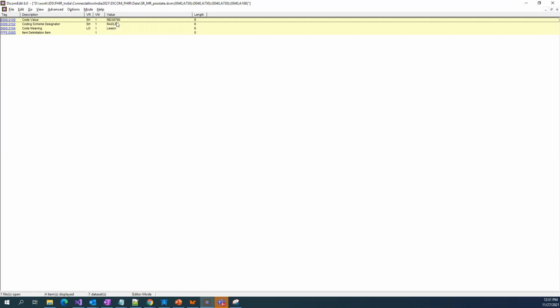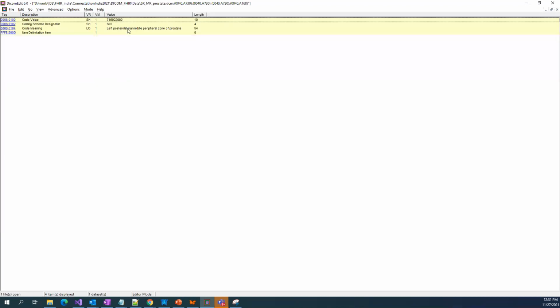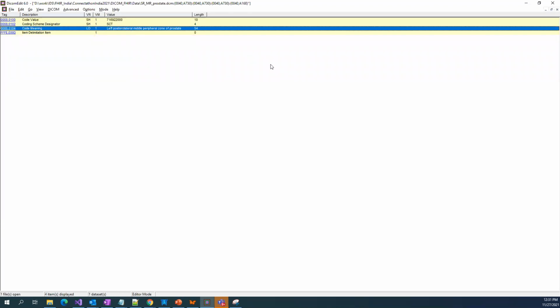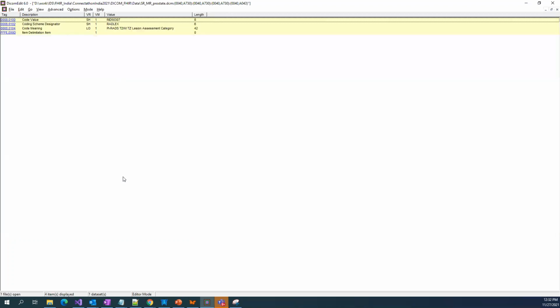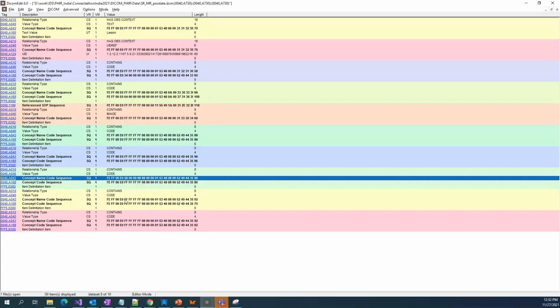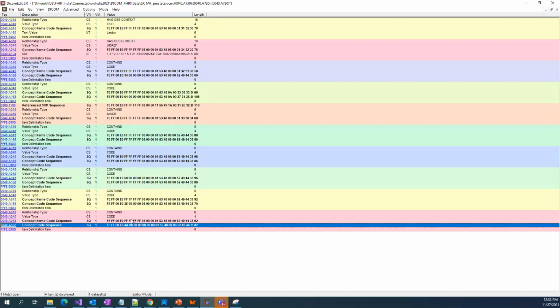So this Radlex 38780 is used to represent lesion. And SNOMED CT, yeah, this one is from SNOMED CT, left posterior lateral middle, and there are LOINC codes. I don't know whether I saw it. Yeah, mainly Radlex and SNOMED CT are what I have seen most.